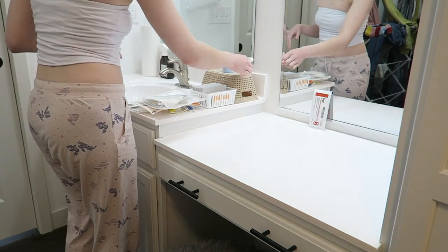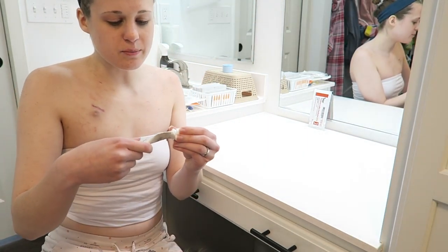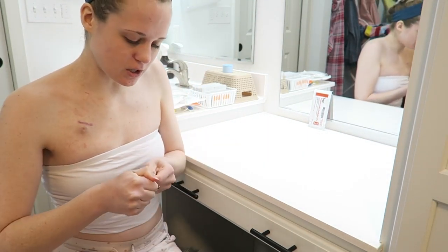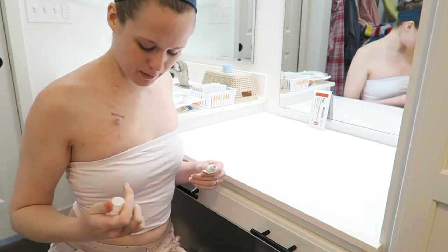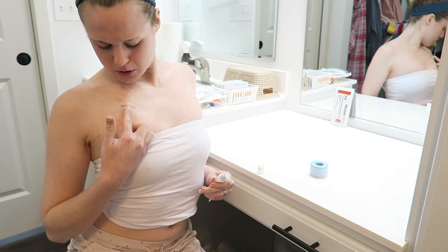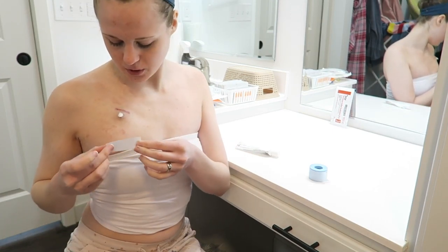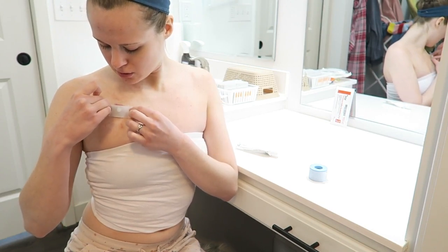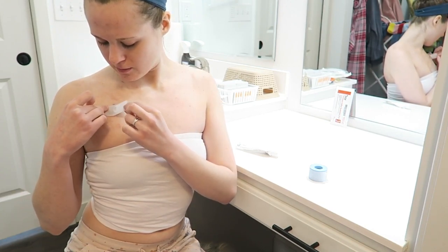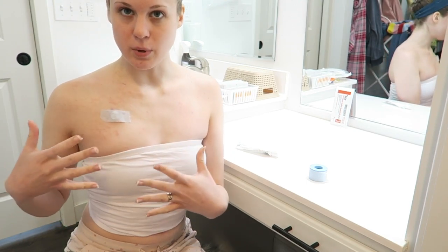First, I'm gonna go ahead and put some Emla cream on. This is basically lidocaine and prilocaine, and I'm just gonna go ahead and put it on top of the port. So we're just gonna set it on top, then we're gonna take a piece of tape and put it on top of there, just while it's soaking in so that I don't bump into it or whatever.